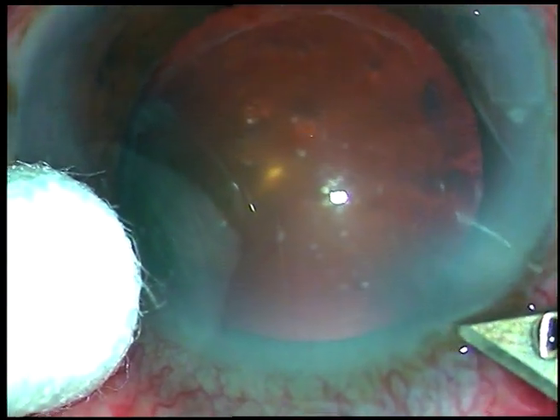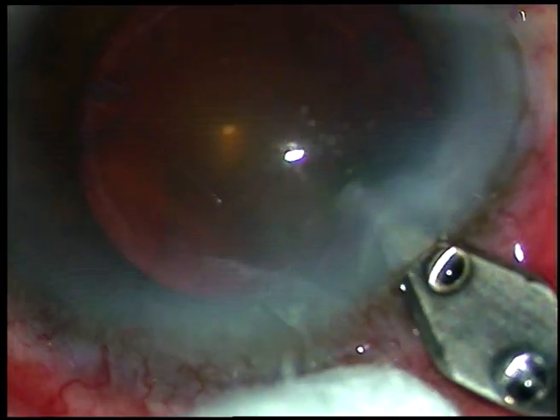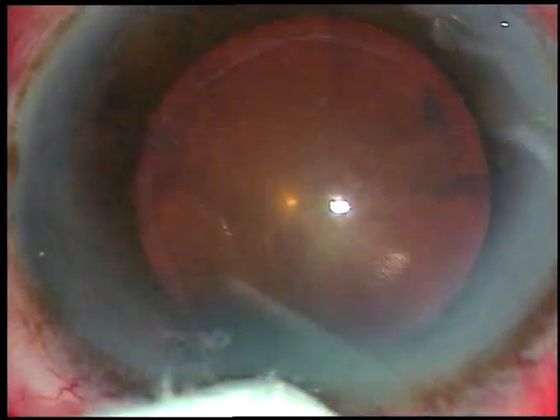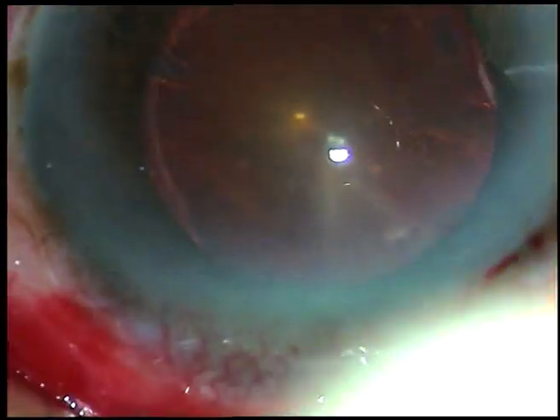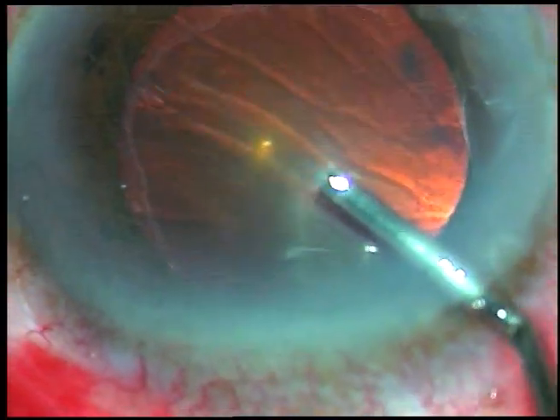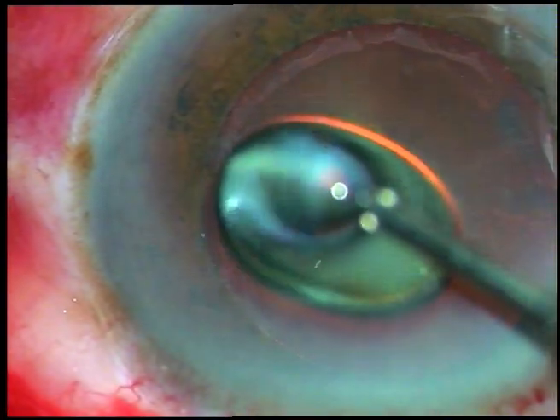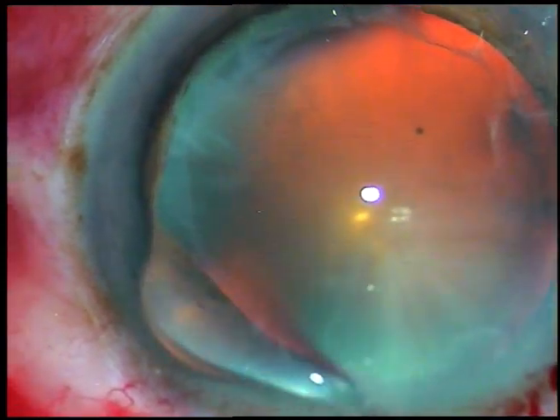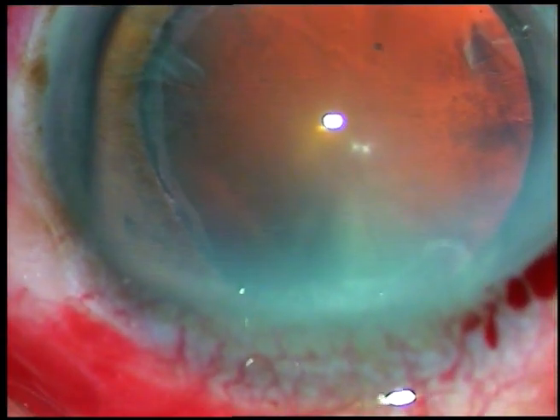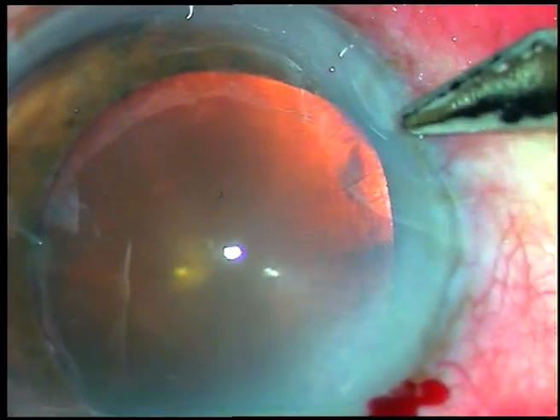This is phacoemulsification of a cataract with pseudo exfoliation. The main incision is being placed and viscoelastic substance is injected into the anterior chamber. We can see the pseudo exfoliation material close to the border of the pupil. Visco has been sprayed toward the endothelial surface.